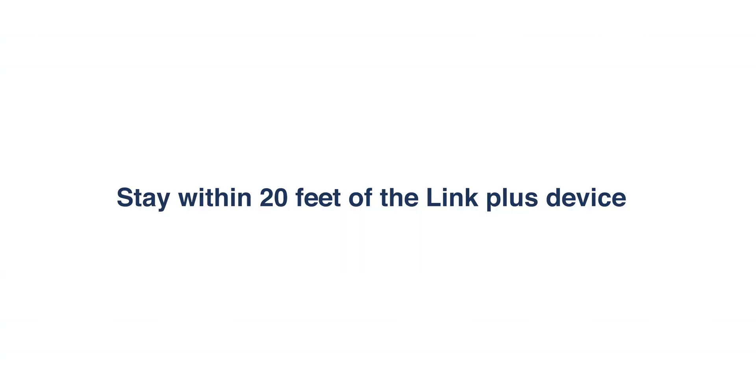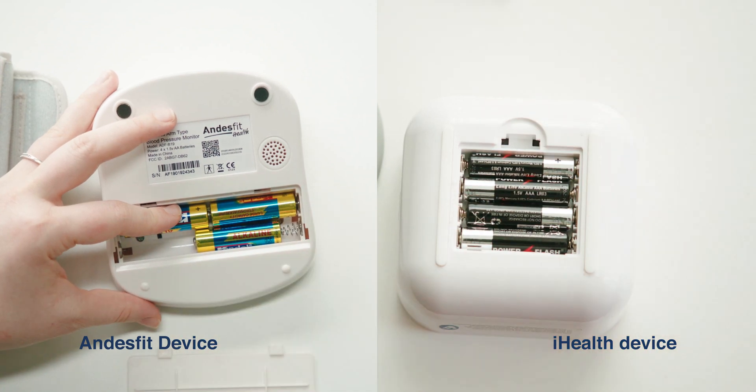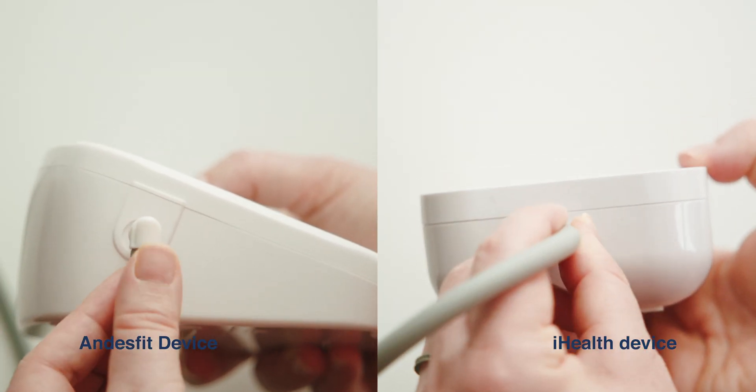Remember, whenever you take a reading on your device, ensure that you're within 20 feet of the Link Plus. First, install the provided batteries. Then connect the blood pressure tube into the device.